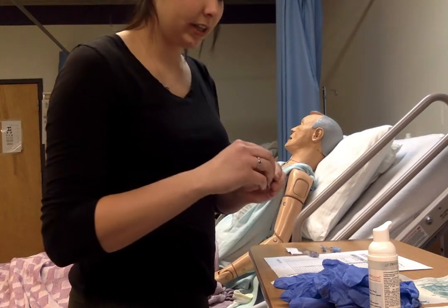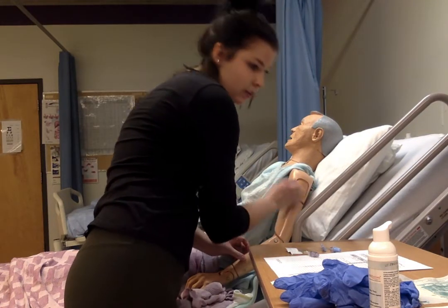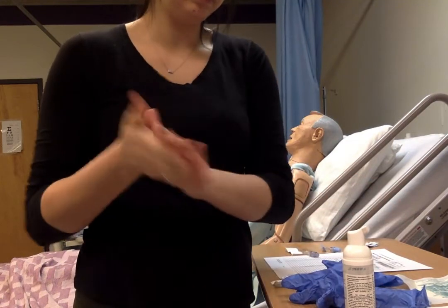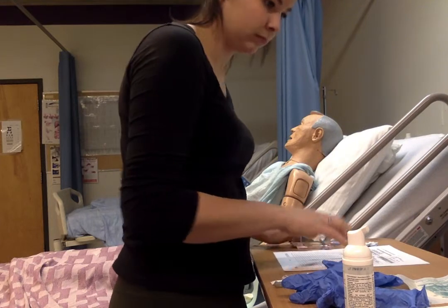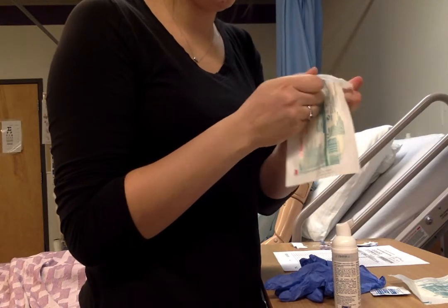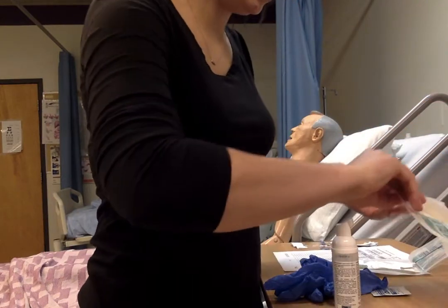And I'm just going to clean the area before I go in. All right, and we'll just let that dry. And in the meantime, we're going to wash again. All right, and I'm just going to get my bandages here ready. So there's one.